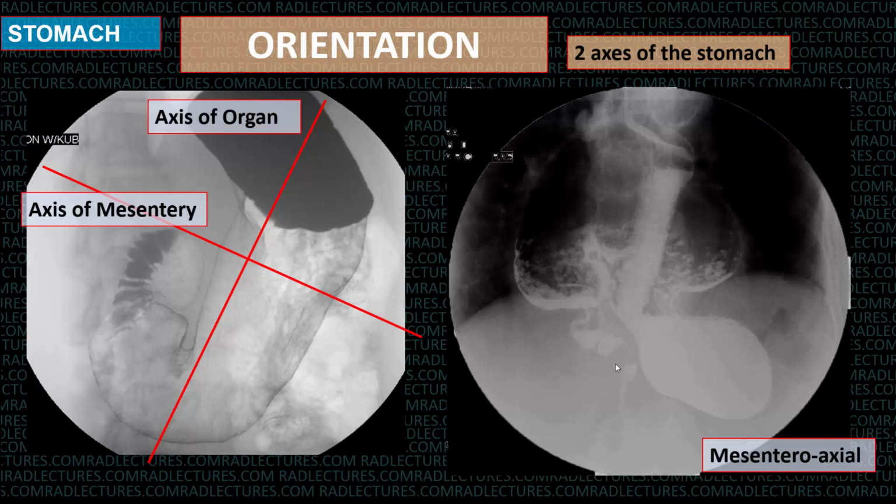It is more serious because one, it can cause obstruction and volvulus, but second, because it is twisting the mesentery like that, and the vascular supply comes through the mesentery also, it can cause ischemia of the stomach and gastric necrosis. Therefore, it is important to recognize this.